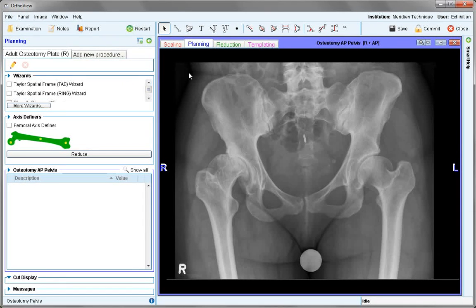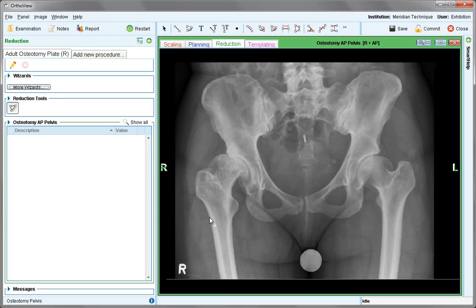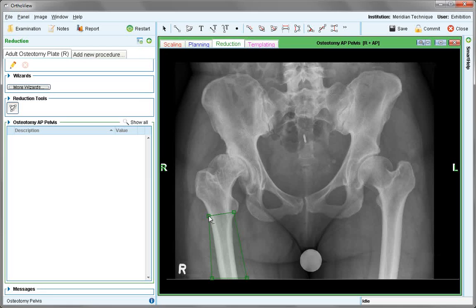The planning stage can be ignored in this case; move straight to the reduction. The reduction tool is selected and used to create an appropriate plan, cutting through the femur perpendicular to the shaft and outlining the extent of what is available on the image. Complete the box by closing or using the escape key, then outline the hip component using the reduction tool to whatever extent is appropriate for the case. Go back to the point where there is an overlap with the original segment and use the escape key to close.